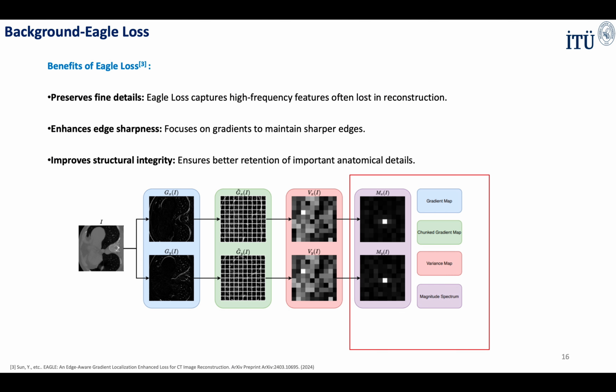HyperCMR optimizes and extends the existing Prompt MR framework. We start by fixing 16 central lines in K-space. SenseNet for sensitivity maps: SenseNet then uses this fixed portion to generate sensitivity maps, which help correct coil sensitivities. The undersampled K-space is transformed into the image domain using IFFT, giving us the undersampled image. We combine the sensitivity maps with the undersampled image to apply coil corrections.